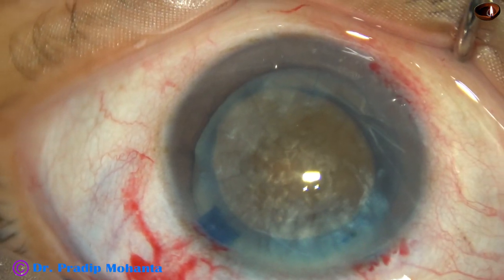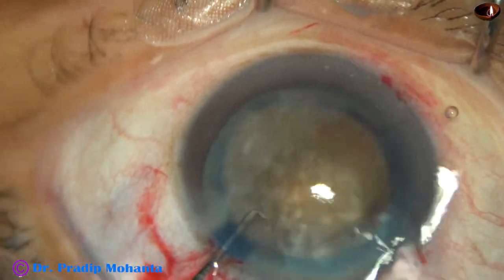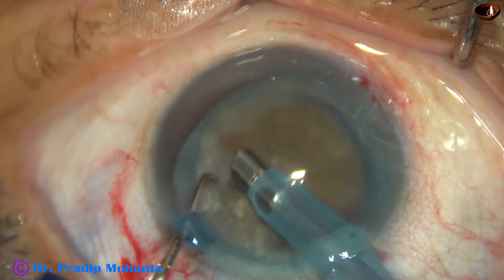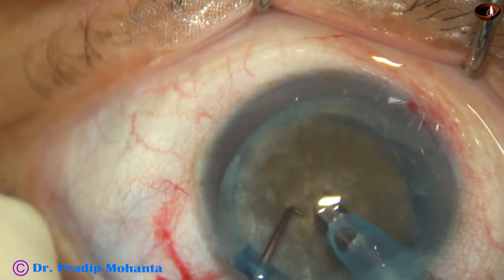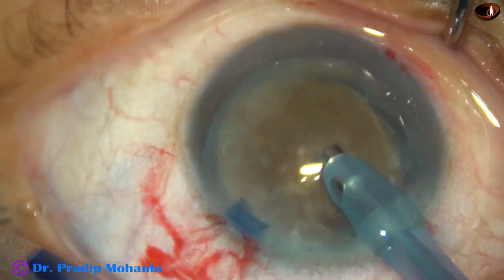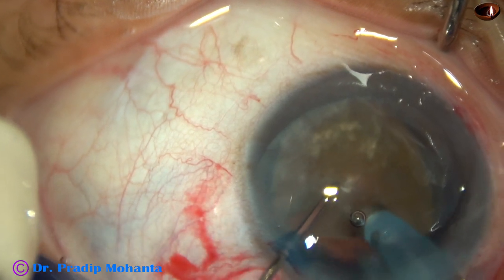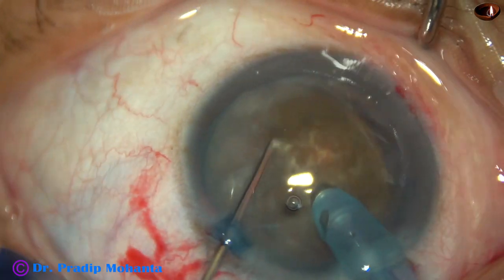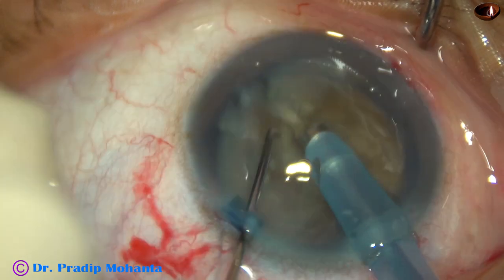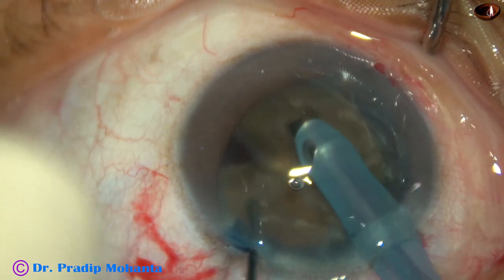This hard nucleus is to be divided into fragments using the submarine chop technique. Some superficial cortical lens matter is removed, the handpiece is turned, the pupil is offset, and the nucleus is pushed slightly down with the tip buried just in front of the main wound. It passes through the substance of the nucleus towards the opposite equator, crosses the hard central core, reaches near the opposite equator, and then the chopper is used to divide the nucleus into two hemi-nuclei.